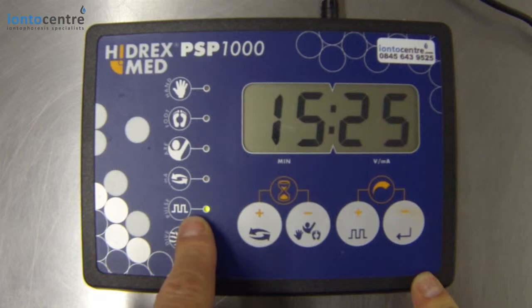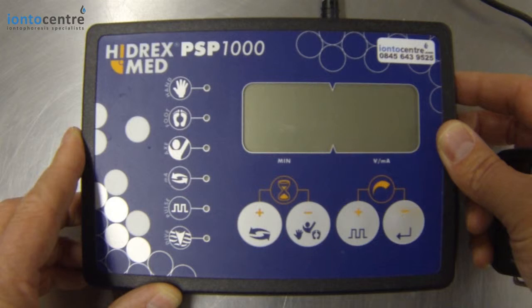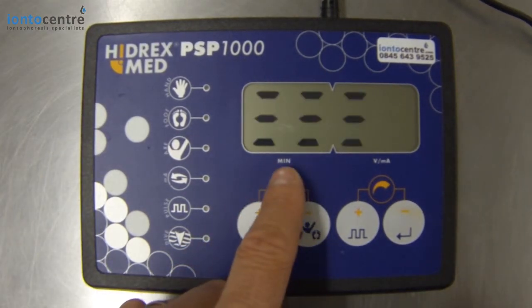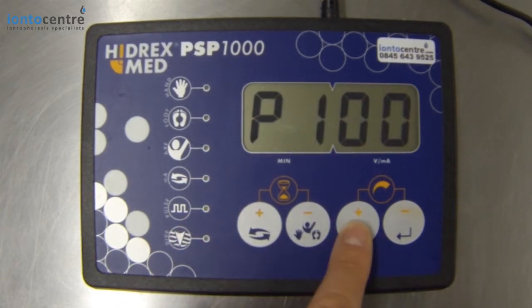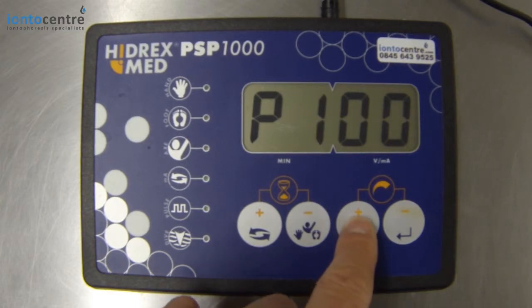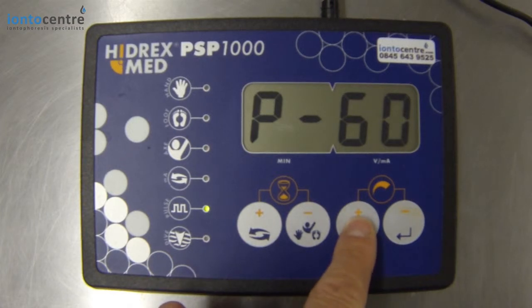To take this machine from pulse current into direct current, you have to access the menu, which you do just after you turn the machine on and the word 'set' appears. You can then touch the pulse button and scroll through your pulse settings. P50 would be your mildest form of pulse current, and you can increase that all the way up to P90, which is the strongest version of pulse current, and ultimately into P100, which is direct current. The pulse light goes off and back on as you scroll through and decide what you want.